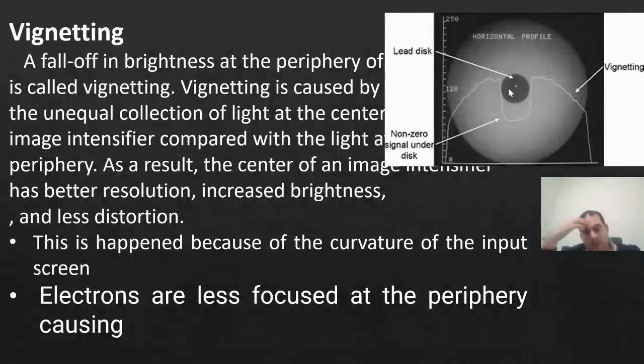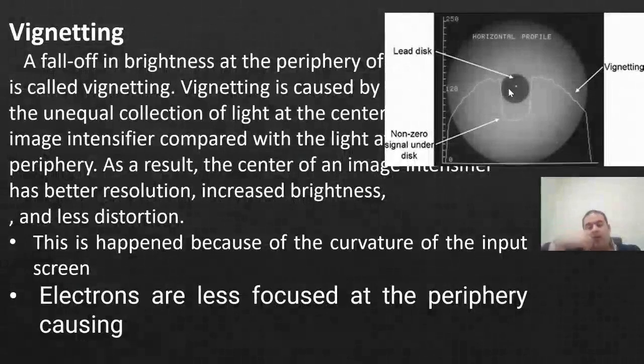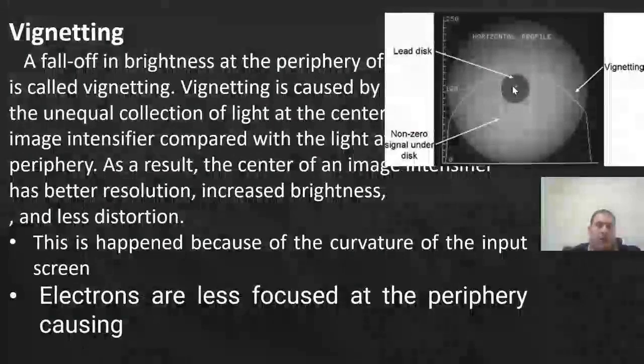Why, doctor, is the background here white and the part with the lead disc appears black? Is this an image negative?